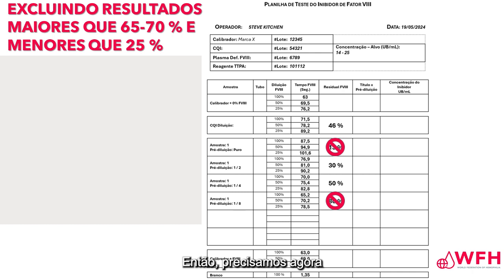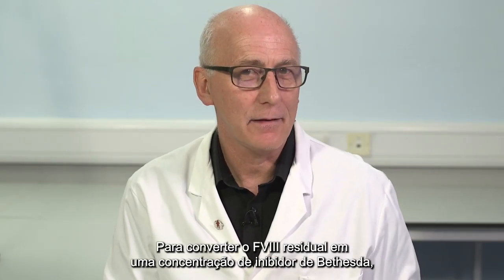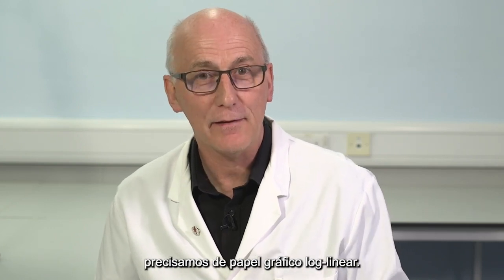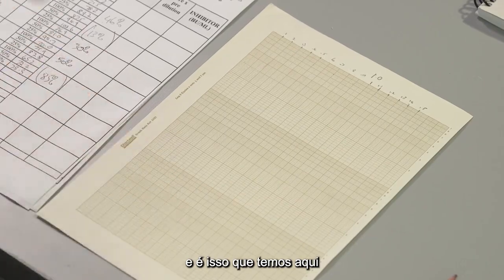So we need now to convert those residual factor 8s into inhibitor concentration. To convert the residual factor 8 into a Bethesda inhibitor concentration, we need log linear graph paper, and that's what we have here.